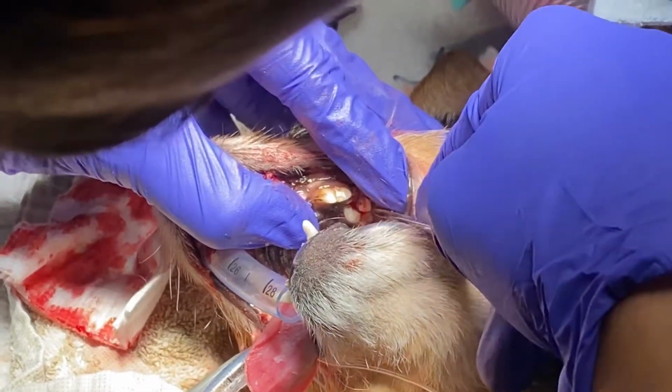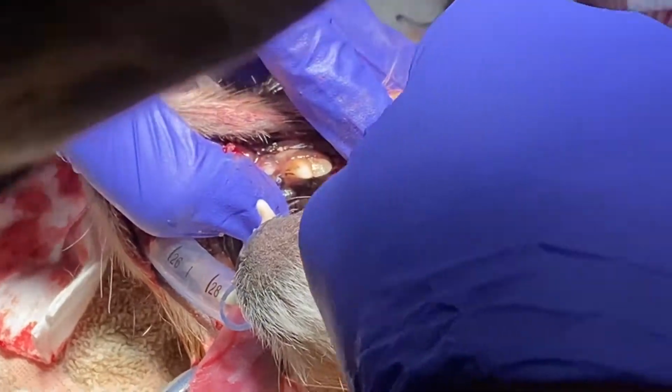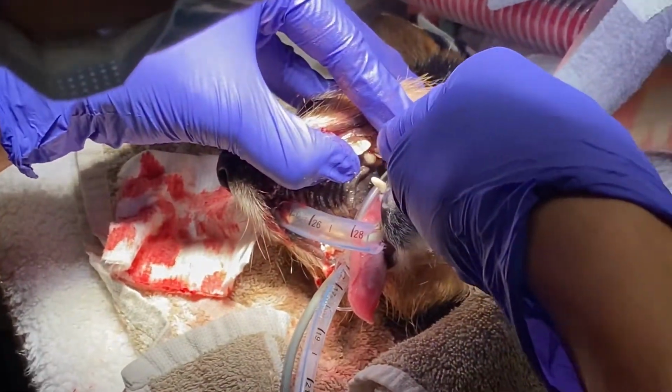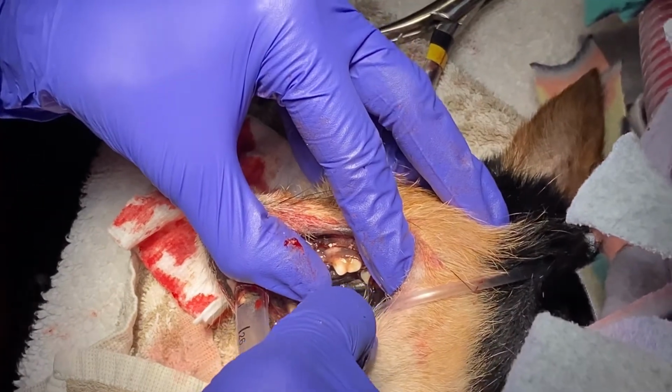Be very careful back here, because you have to think of the structure that is right above where this tooth is. The eyeball. If you accidentally penetrate too deeply as you're trying to extract this tooth, you have the risk of puncturing the eyeball.